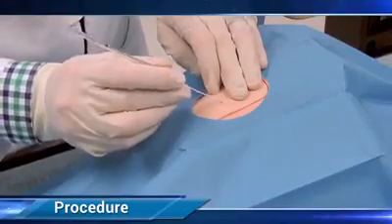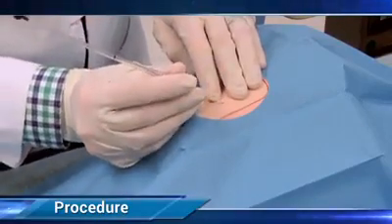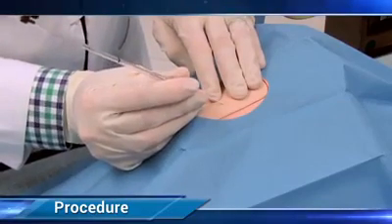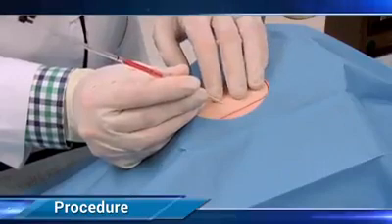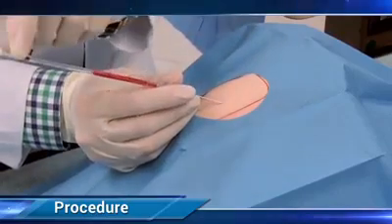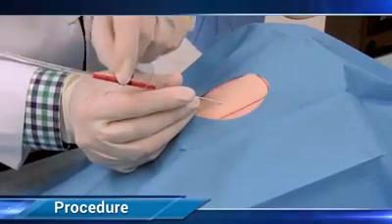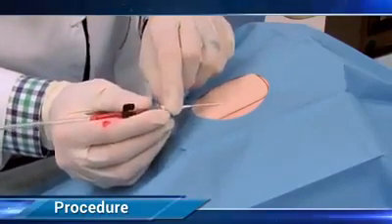The needle should enter the skin at approximately 30 to 45 degree angle, directly over the point at which the pulse is palpated. Once a flash of blood is obtained, it should be bright red and seen in the hub of the catheter. The needle should then be advanced another 2 to 3 millimeters so the bevel fully enters the vessel. Advance the wire and drop the angle of the catheter 10 to 15 degrees to make it easier to advance the catheter into the vessel.